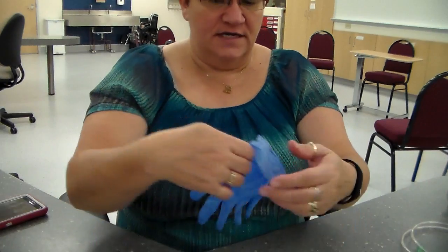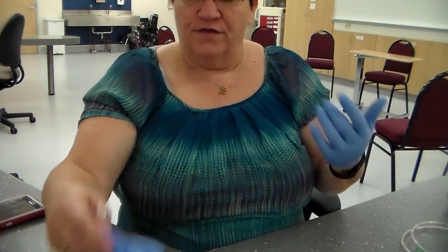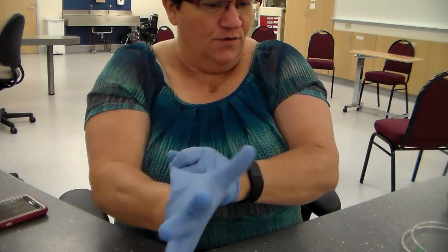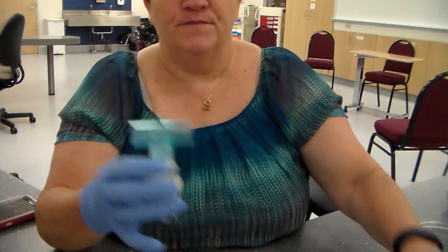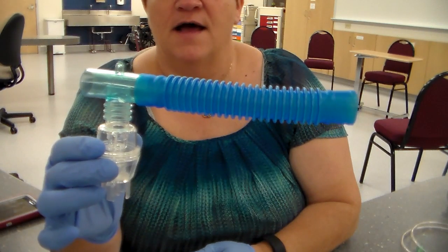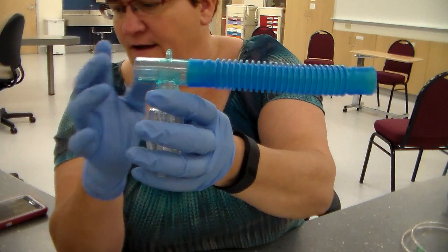Then you're going to go into your patient's room and perform WIPSA. Now you're dealing with a patient's mouth, oral secretions. You may want to put some gloves on. All right, so we performed WIPSA. We're going to place the medication in the nebulizer chamber. First of all, this is what the nebulizer is going to look like, and there's going to be a white mouthpiece here.